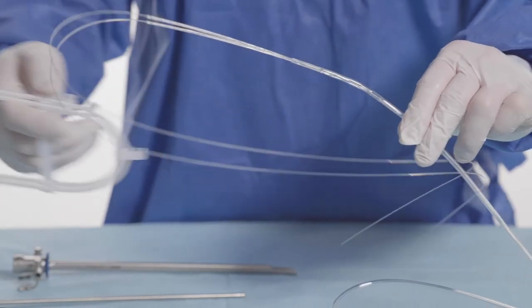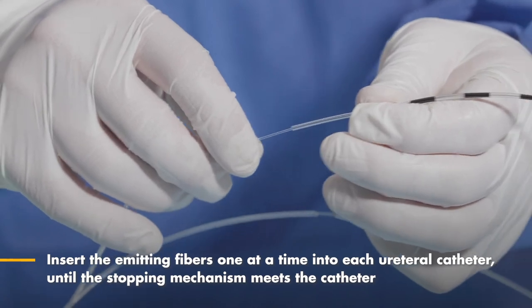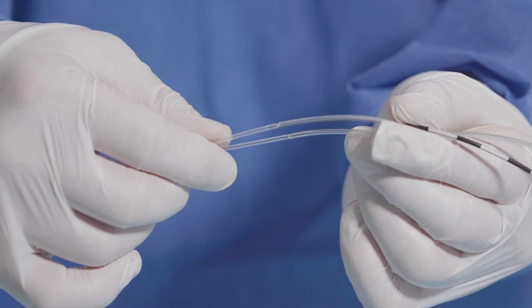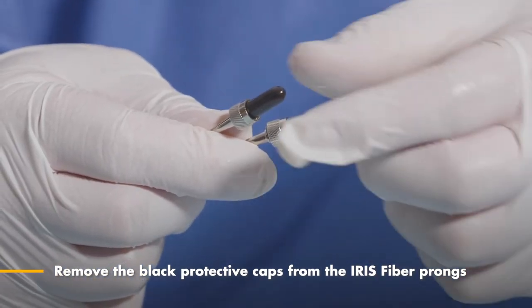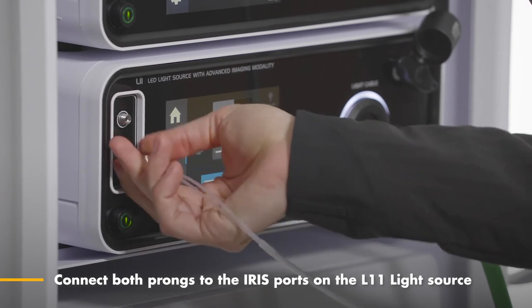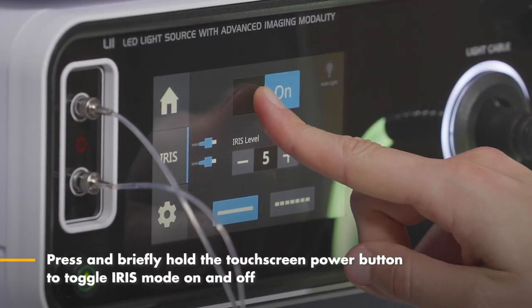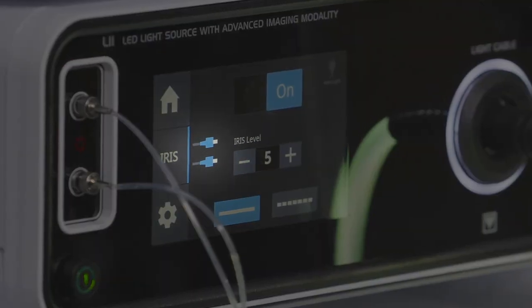Carefully remove the emitting fibers from the plastic casing. Insert the emitting fibers one at a time into each ureteral catheter until the stopping mechanism meets the catheter. This stop feature prevents the emitting fibers from going past the distal end of the catheter. If you have trouble inserting the fibers all the way to the stopping mechanism, mineral oil can be applied to the emitting fibers. Remove the black protective caps from the Iris fiber prongs. Select Iris on the light source home screen and connect both prongs to the Iris ports on the L10 or L11 light source. Press and briefly hold the touchscreen power button to toggle Iris mode on and off. You will see an indicator on the screen next to each port notifying that the prong is securely fastened.